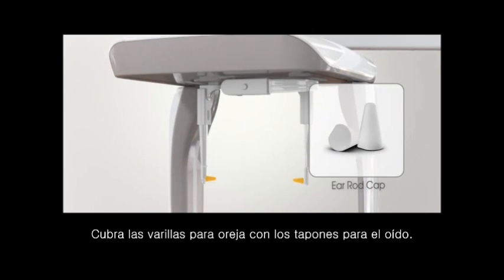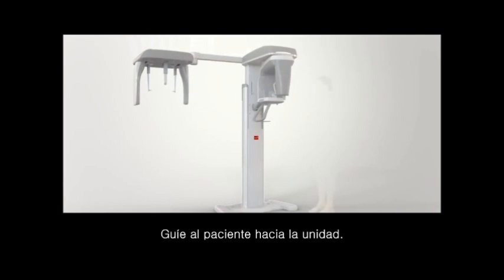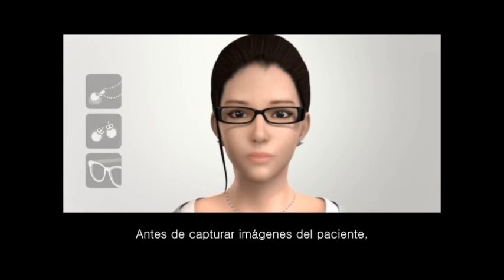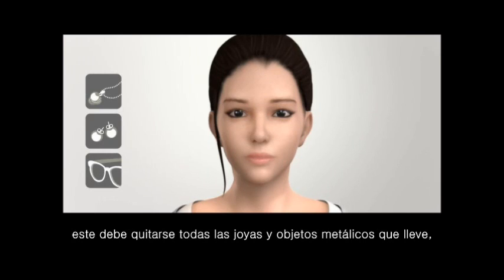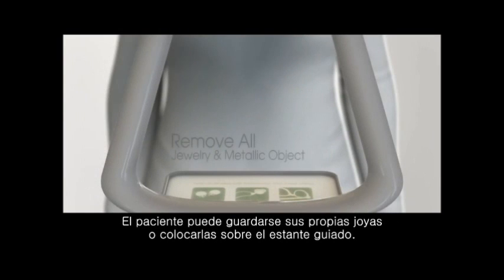Cover a cap over the ear rod for patient safety. Guide a patient to the unit. All jewelry and metallic objects, such as necklaces, earrings, hairpins, eyeglasses, dentures, and orthodontic appliances should be removed before patient image capturing. Patient can keep their removed jewelry personally or place them on the guided shelf.